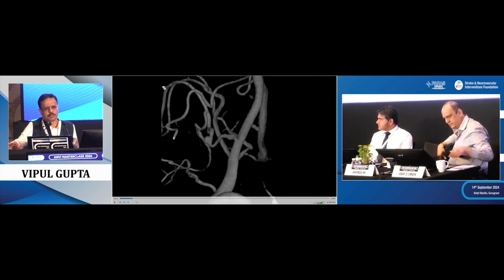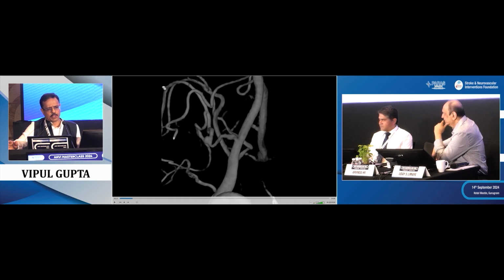So that is very important. Distal PICAs, we have done a lot of occlusions. We do few reconstructions. Acutely ruptured distal PICA usually does very well with parent vessel occlusion. We don't even do testing. We just go ahead and occlude this artery. But this was slightly proximal. This is where perforators can be there and everything.